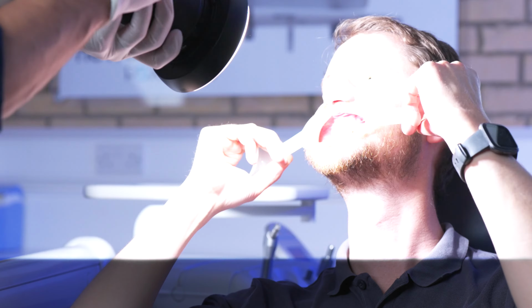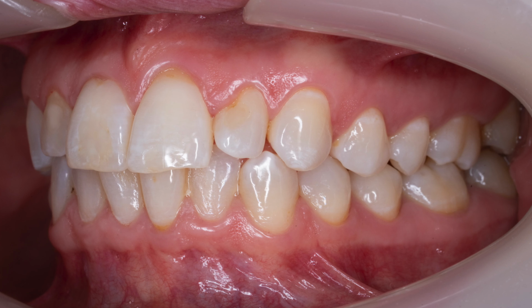When undertaking the oblique or lateral views, you are again aiming for the occlusal line to be straight in the frame, ensuring there is equal space on either side. You want to capture all the teeth from an oblique perspective, so you would aim for the canines to be perpendicular to the camera plane. Any further round and you will risk losing the posterior teeth from the image.